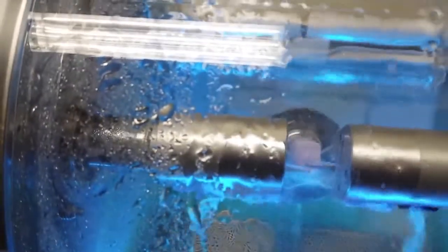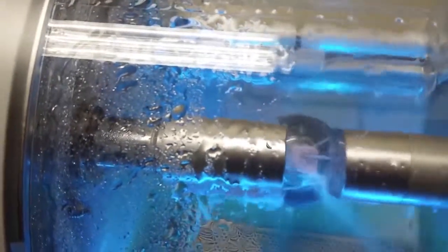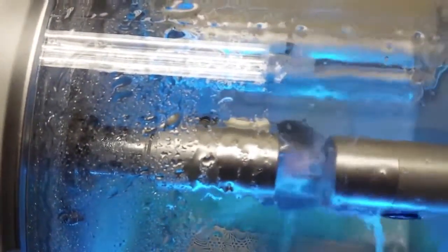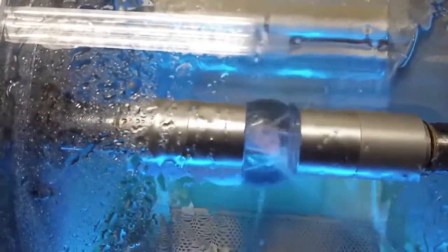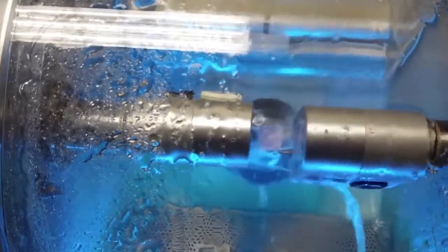It's very nice because we have a lot of control over this. If we have an issue, for some reason, a fitment, something we don't like. Yeah. So we just, you're here, the machine's here. We're going to make some adjustments, but we re-image and we remake. Wow.